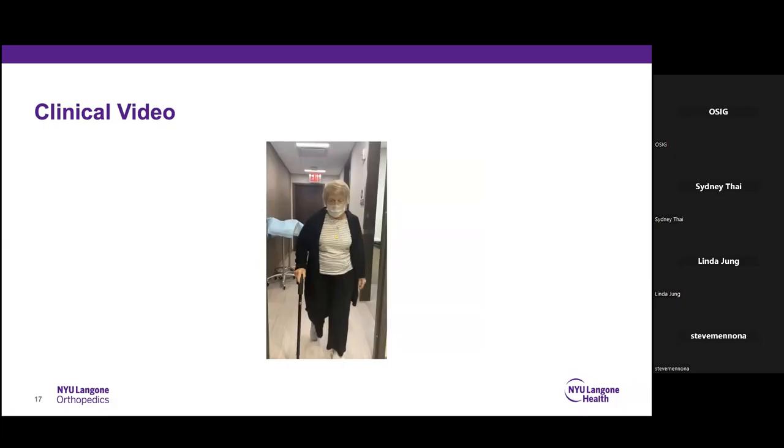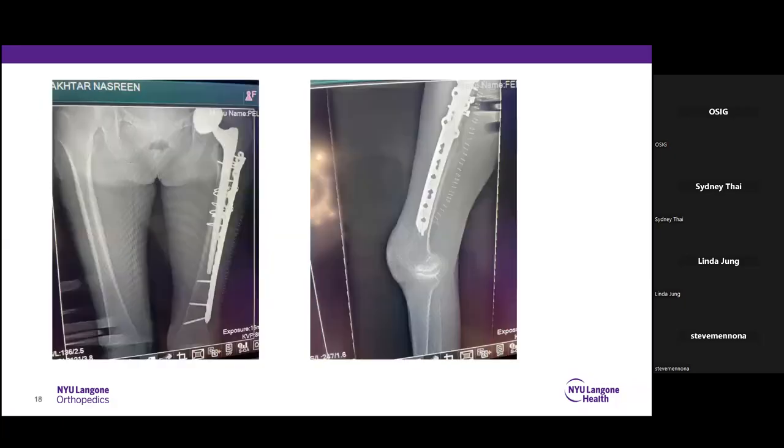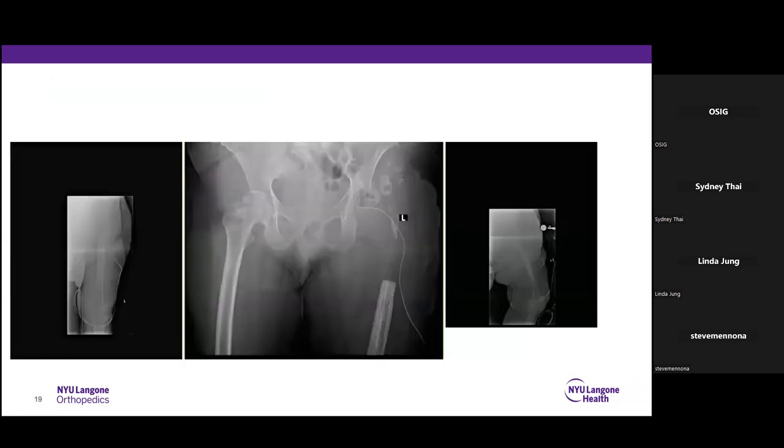So you as a physician are a healer, and you can make them do better. Now, sometimes things don't go well in the OR, and you can break the femur intraoperatively, like we were saying. So that was something that I did a couple weeks ago that Jomar talked about. This is a patient that has a chronic infection and has undergone multiple revision surgeries. We actually had to take out her entire bone because this was infected with a fungus called Candida albicans. And you can see that you guys wouldn't really know to look, but this bone is really horrible here. And basically her options are very limited.